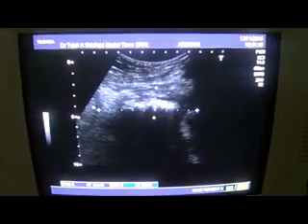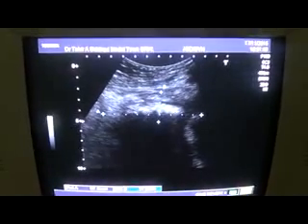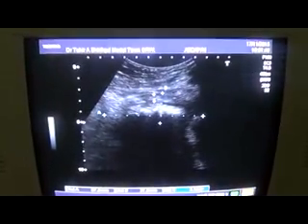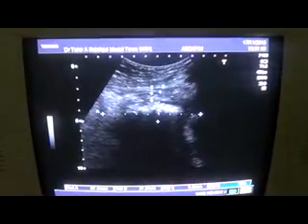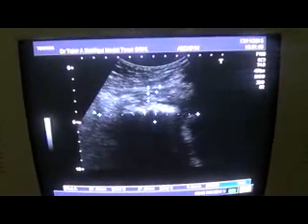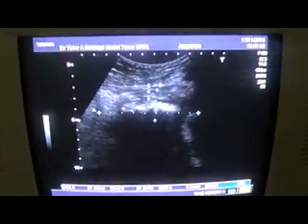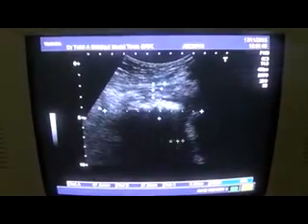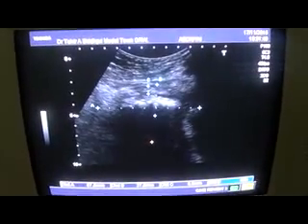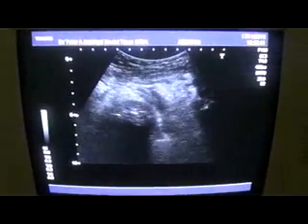However, in anterior posterior diameter it measures 2.7 centimeters, and its wall. This is the wall of the bowel segment, measuring 6.8, and more than 5 is considered to be pathological. So this is the bowel gases, collapsed lumen of the bowel with gases, dirty shadow from it. So there is a bowel related mass in the region of the right lower quadrant that extends up to the point of insertion of the ureter.